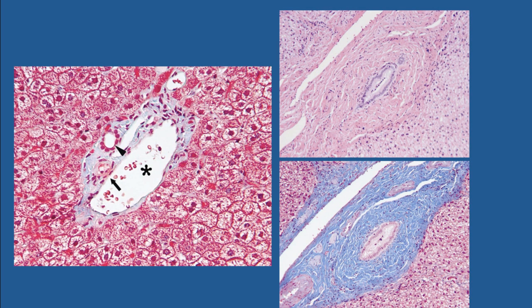So moving on then with other aspects of fibrous tissue in portal tracts. Portal tracts, as I just showed you, come in all shapes and sizes. And this is the classic textbook example of a small portal tract where you have very little fibrous tissue and small structures, the bile duct, hepatic arteriole, and the portal vein. But remember that in the liver, you will also have large portal tracts. And here is an example of a large portal tract.